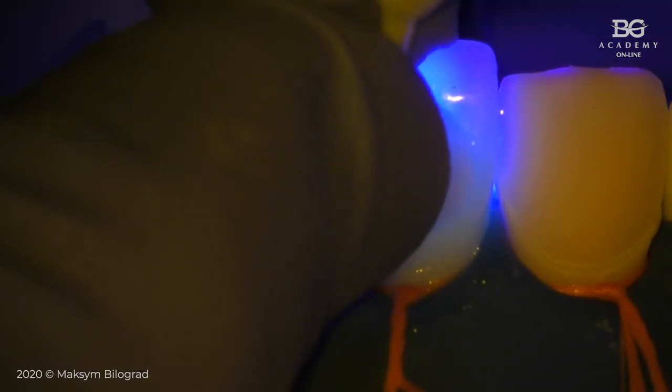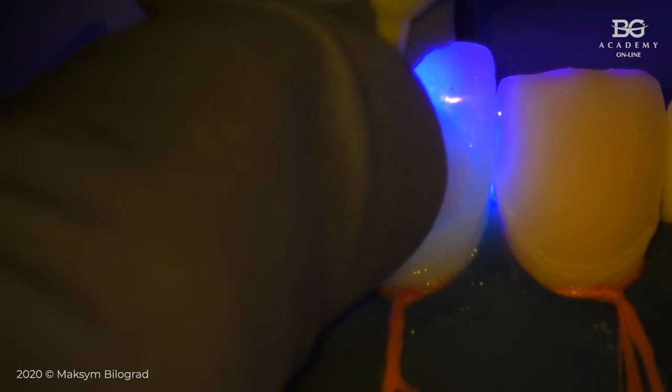At this stage I will light cure, my assistant actually does it, from palatal side. We light cure from palatal side for 20-30 seconds. Why from palatal side? The reason number one is that my fingers are on the buccal side and I cannot put my lamp on my fingers. But there is another reason, because we are light curing through a translucent object, which is tooth.